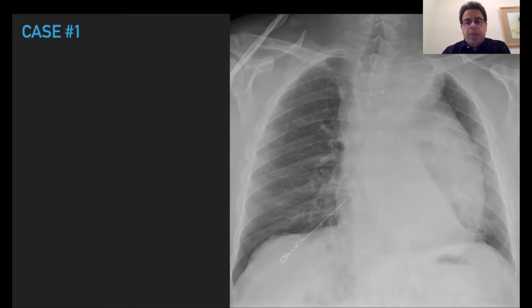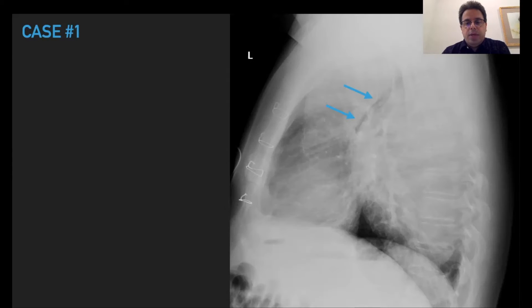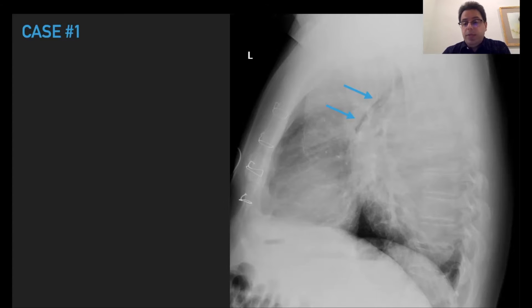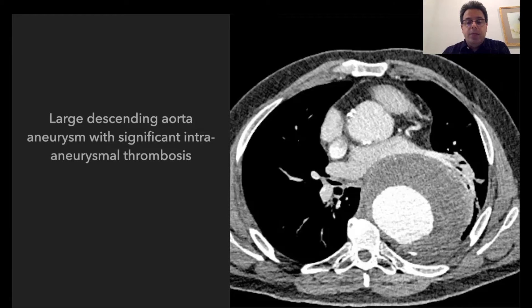The first case: PA chest x-ray shows a huge mass over the mediastinum. The lateral view helps localize this mass, showing that it is pushing the esophagus and trachea anteriorly, which makes it a good location for the posterior mediastinum. One of the structures in the posterior mediastinum is the aorta. This is a huge descending thoracic aneurysm with a large intra-aneurysmal thrombosis.